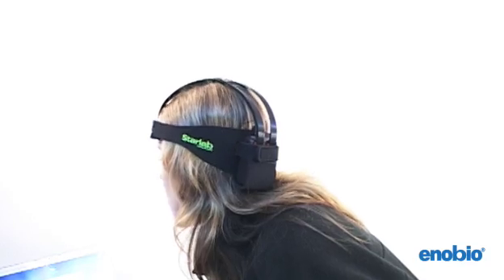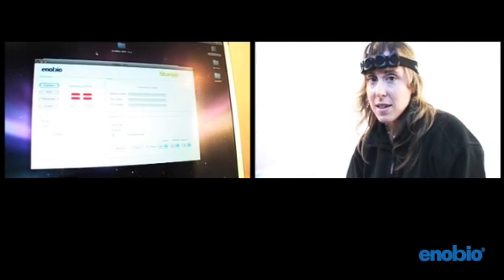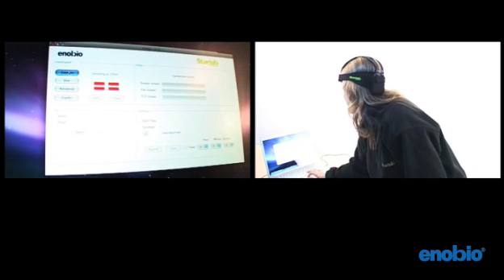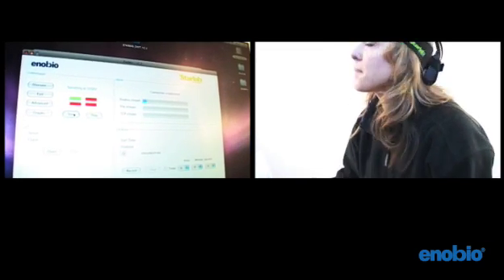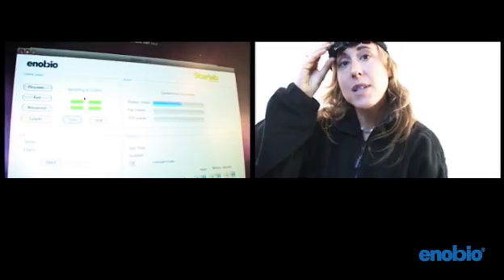I start the software application which is Java based and doesn't require any installation. First I click connect to connect the wireless device to the laptop and then I'm ready to begin. The electrodes first need to calibrate which can take anywhere from a couple of seconds up to just a couple of minutes.